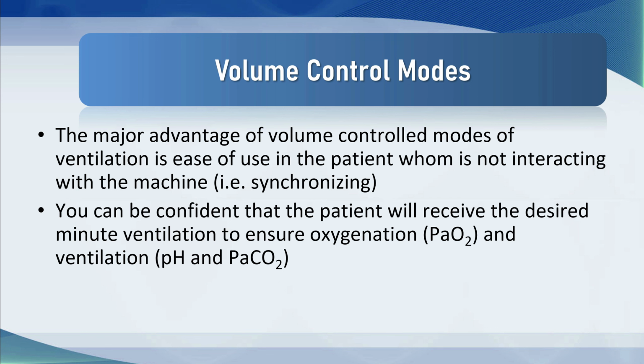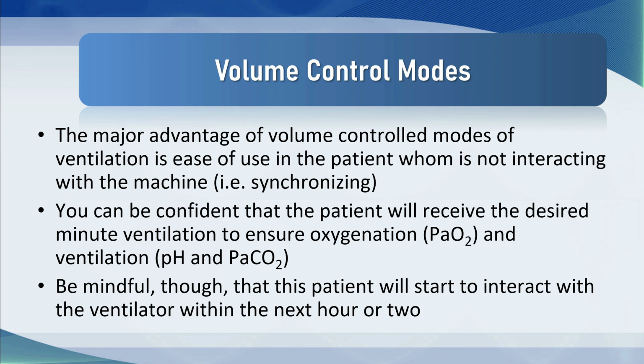But for most people, you have to turn these drugs down to let the diaphragm move, because the diaphragm almost wants to be moving and it becomes dysfunctional if it doesn't. So you have to be mindful that even if you put Leonard on a mode of ventilation that's purely just giving him volume all the time, at some stage he will want to interact with that ventilator in the next hour or two. And that's why there has to be some form of ventilatory assistance in an ICU ventilator.